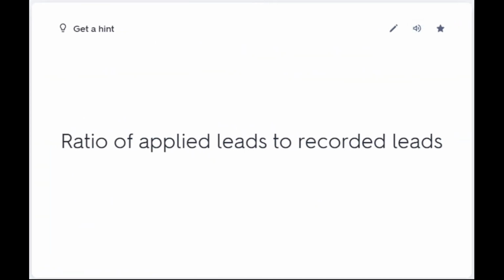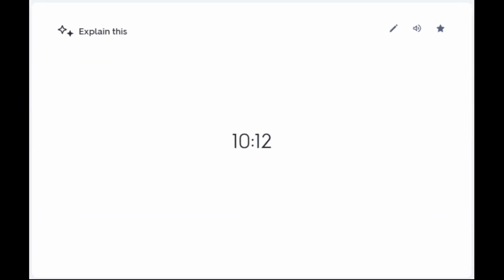Ratio of applied leads to recorded leads: 10-12.